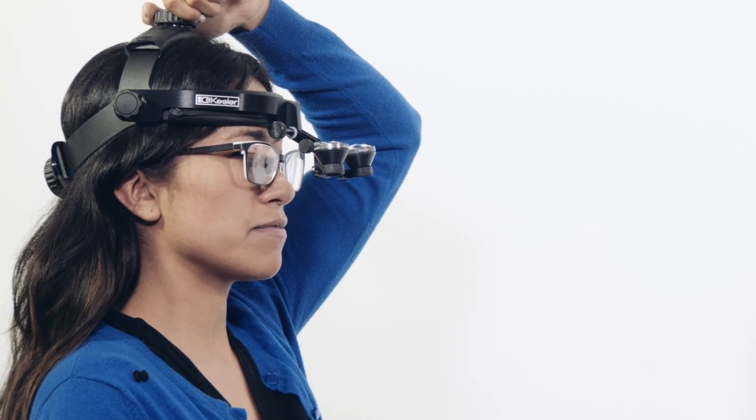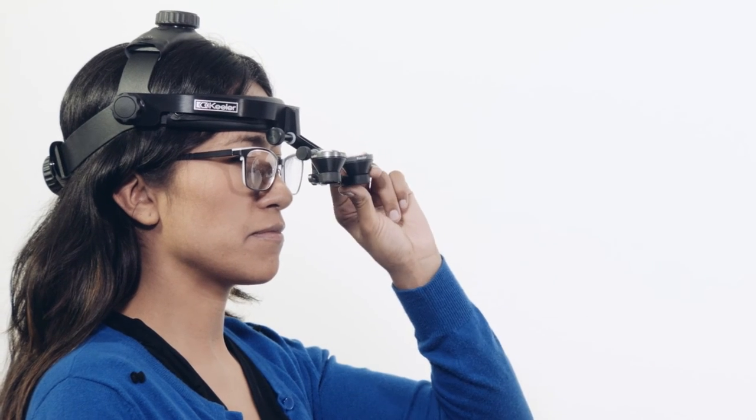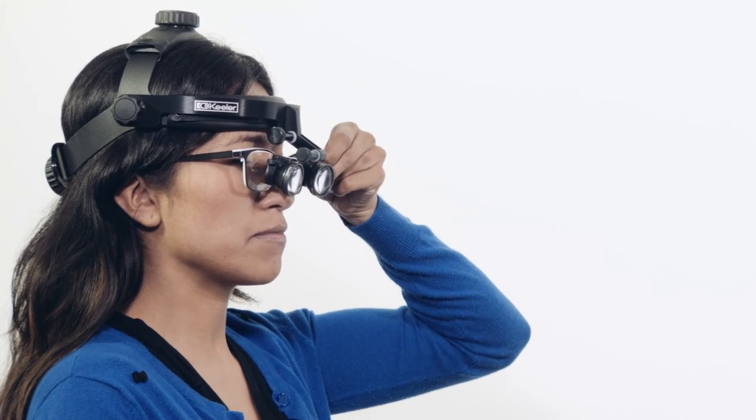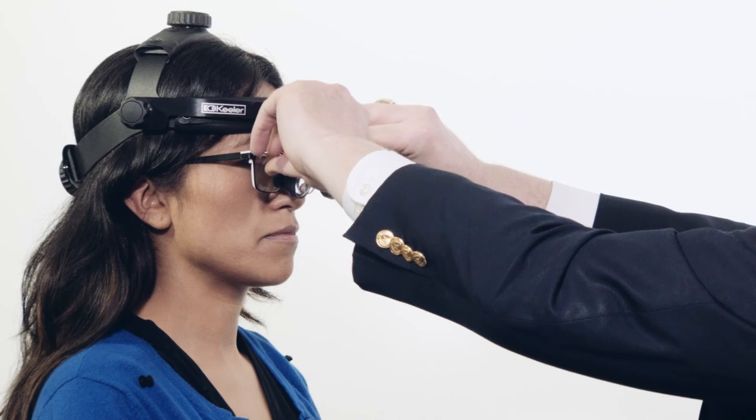If you have Keeler loops fitted to a headband, position the telescopes in approximately the correct position in front of your eyes. Loosen both adjustment knobs and vertically align each telescope.